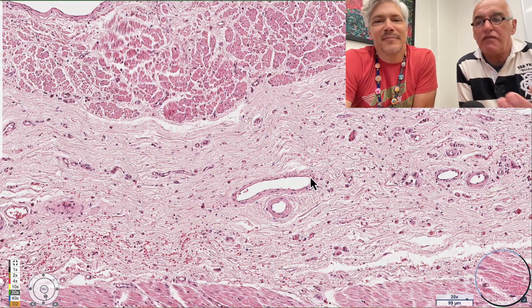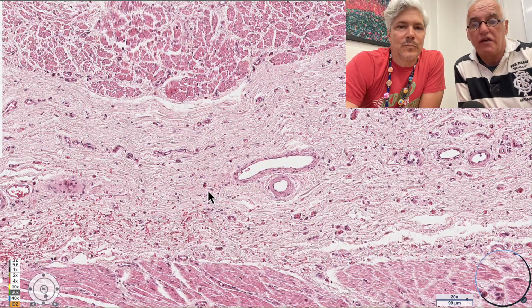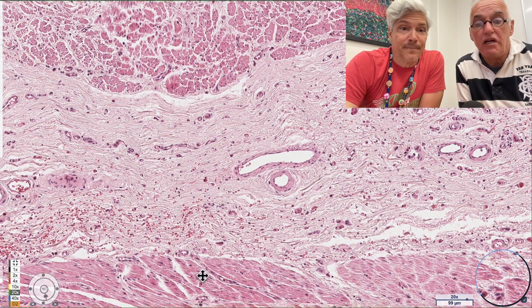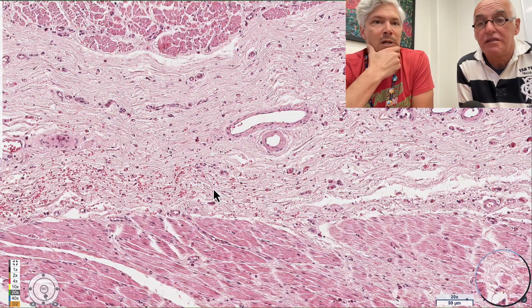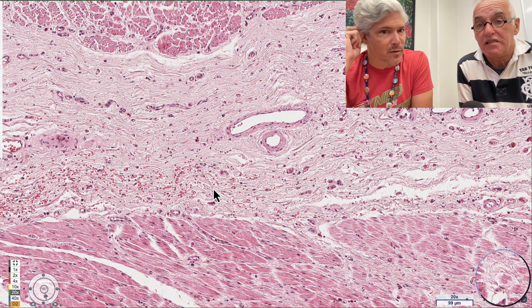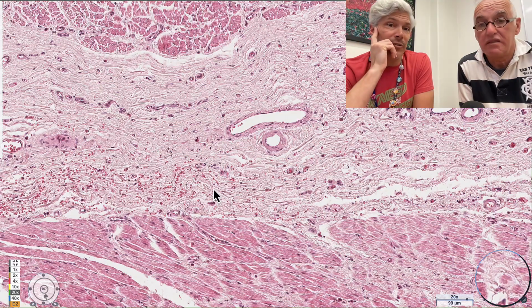All right. So we have nervous system in there. We have connective tissue. We have muscle on either side. Muscle here, and more muscle down here. And so, what's the point of the submucosa? It's a connective tissue layer separating our mucosa from our large muscularis propria or externa, and it certainly supplies a route for blood vessels and nerves.